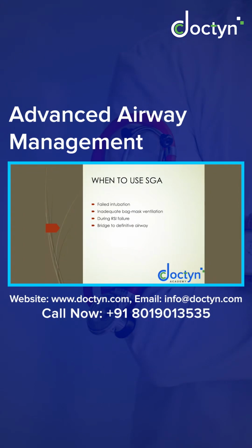When to use a supraglottic airway? There are different aspects where the supraglottic airway can be used. It can be used as an immediate airway measure once you have tried intubation. So let's go with the sequence.